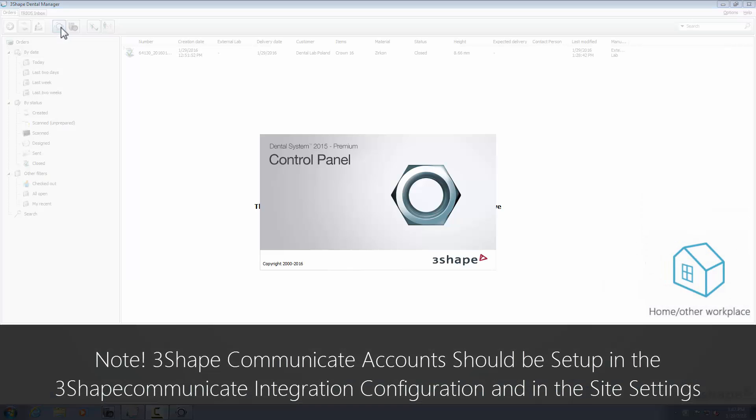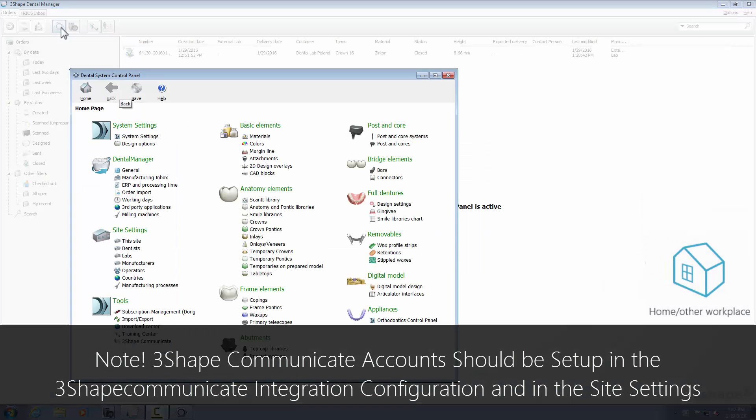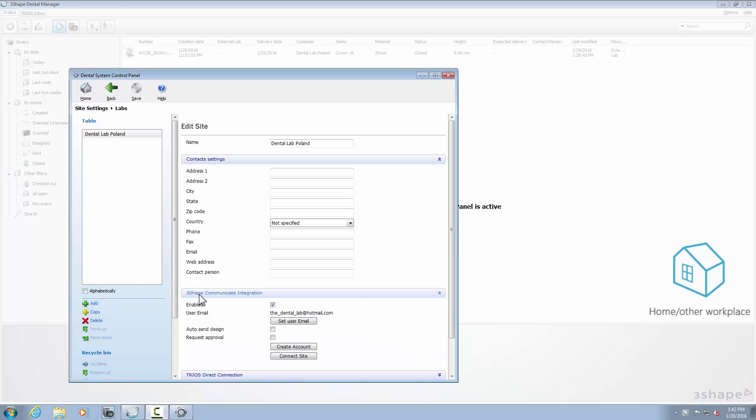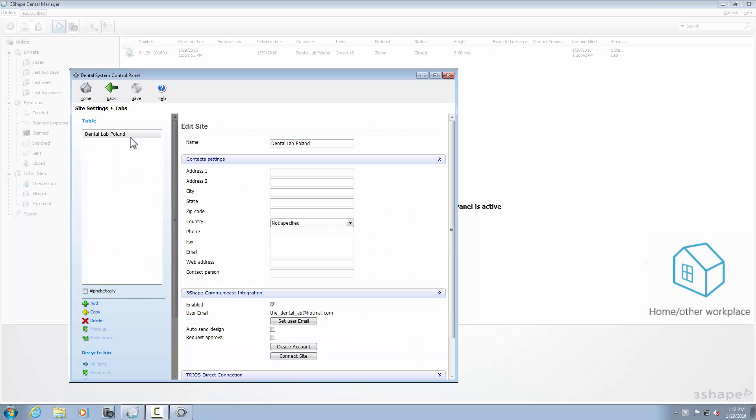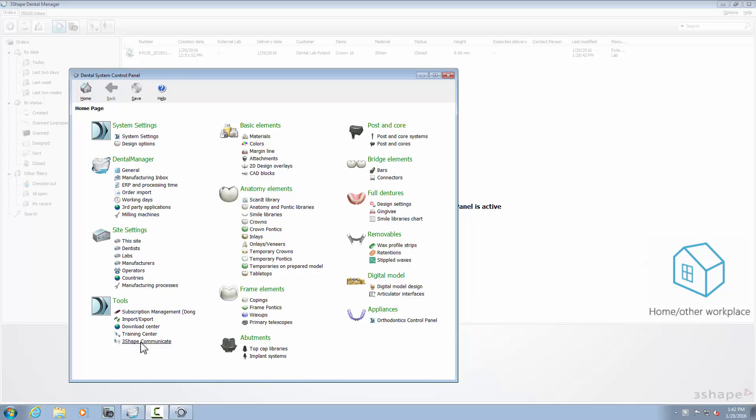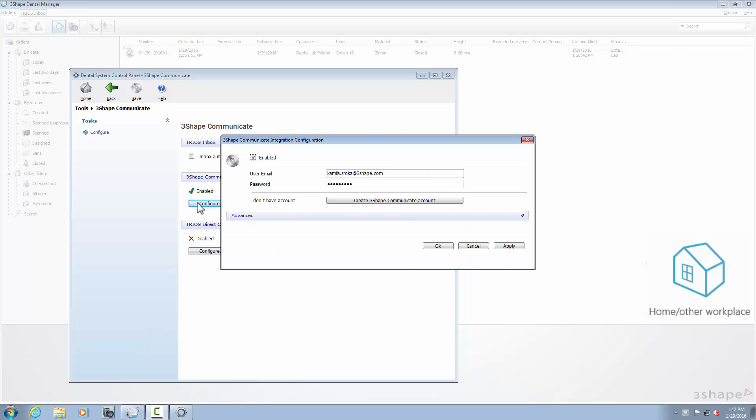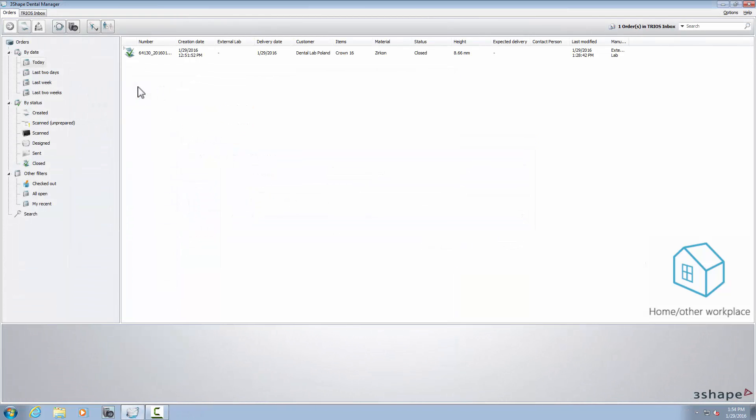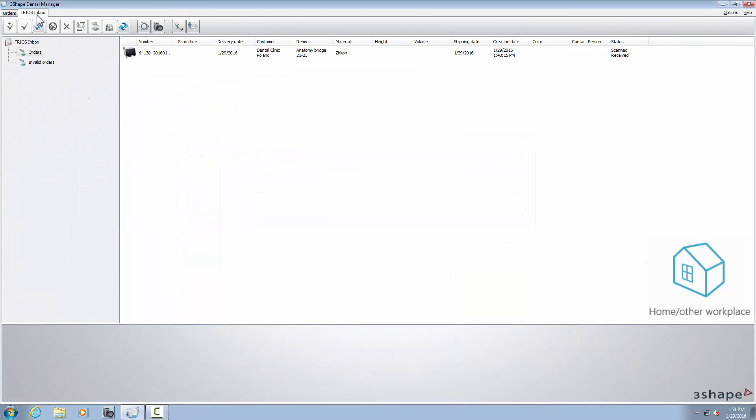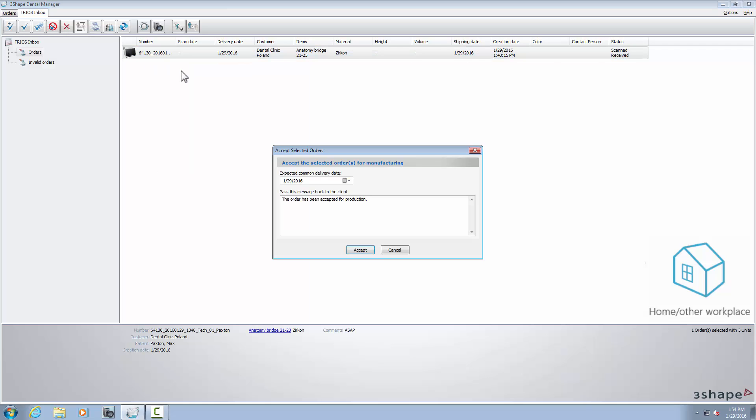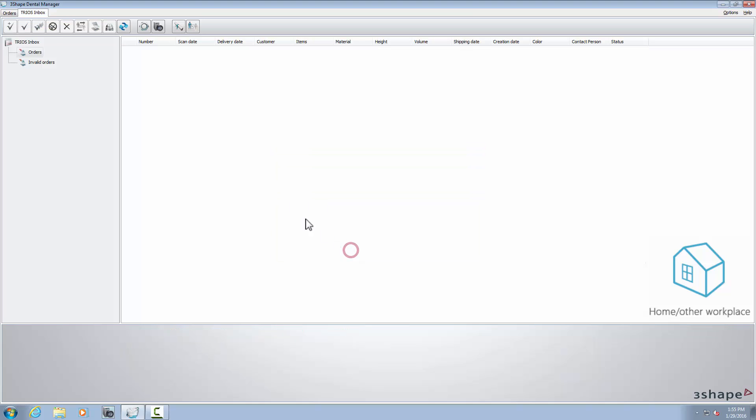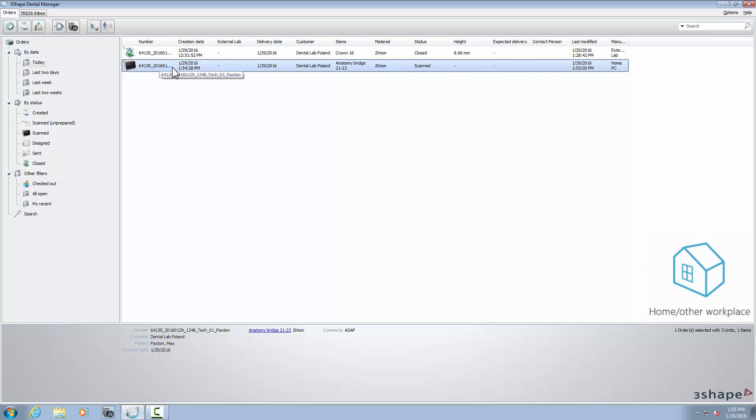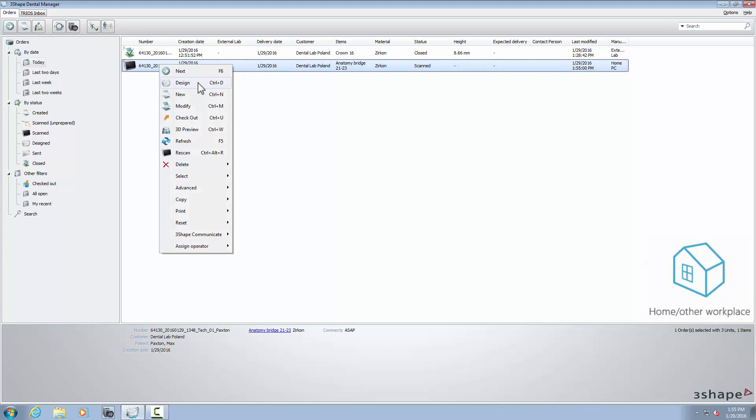To receive and send updates to your work lab, do the same as before by setting your 3Shape Communicate account in the Dental System control panel. The procedure here is the same as in the previous scenario. Each time you get an order, you need to accept it in the TRIOS inbox. After that, design the case, save it, and when it's done, send it back to the lab.